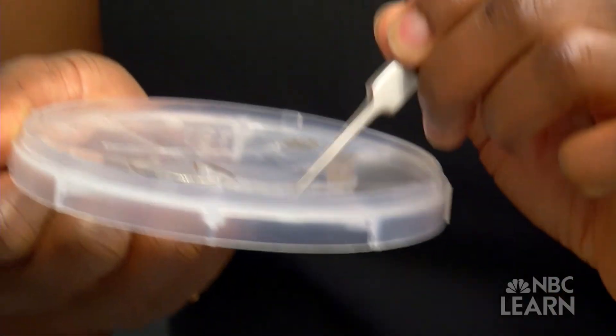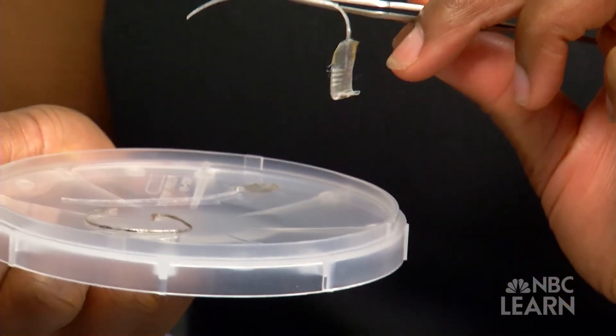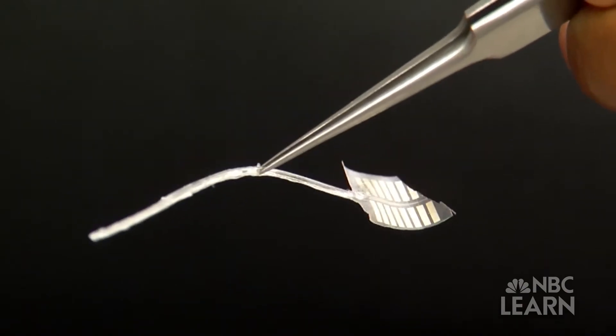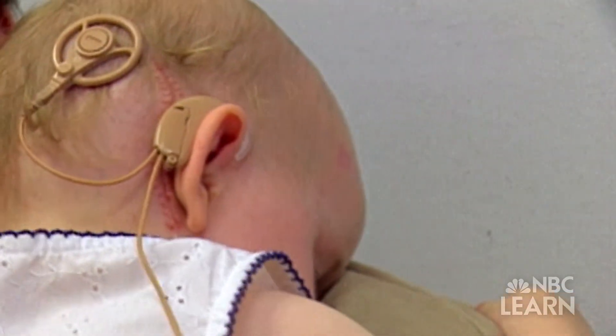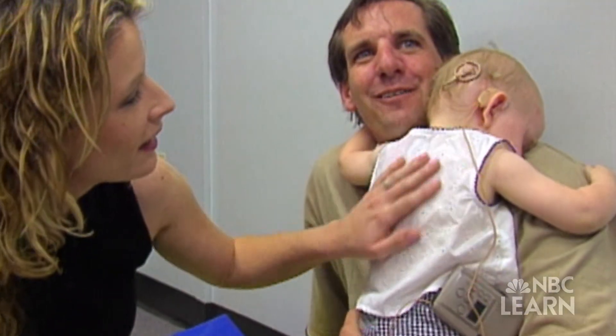The prototypes of the arrays are then sent to a practicing surgeon at Ohio State University to test the devices in human cadavers, a necessary first step before use in living people.